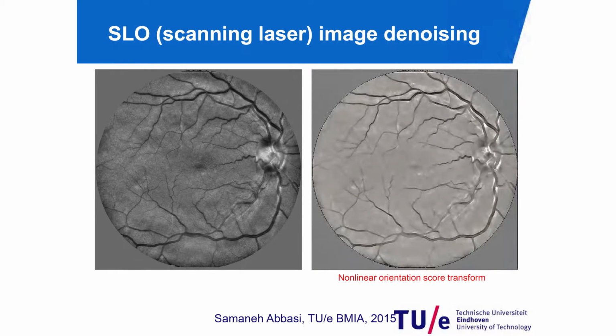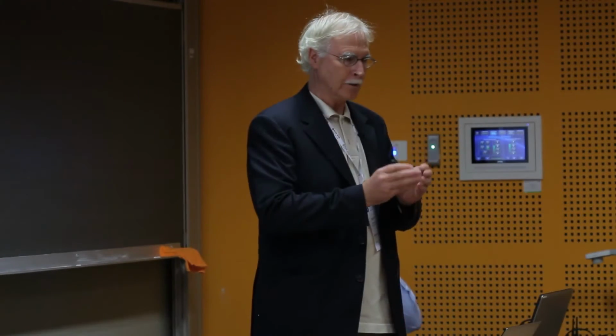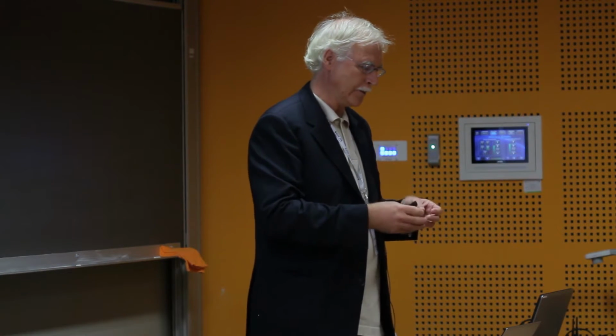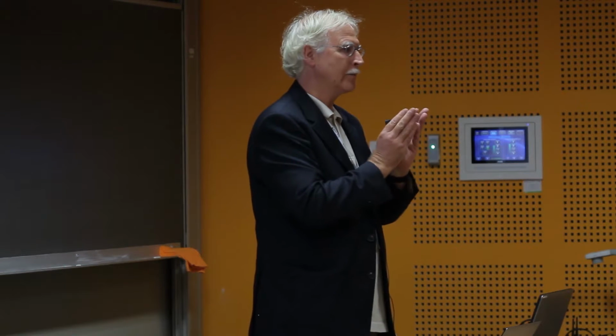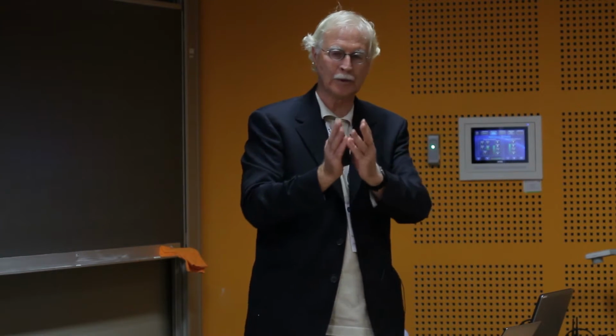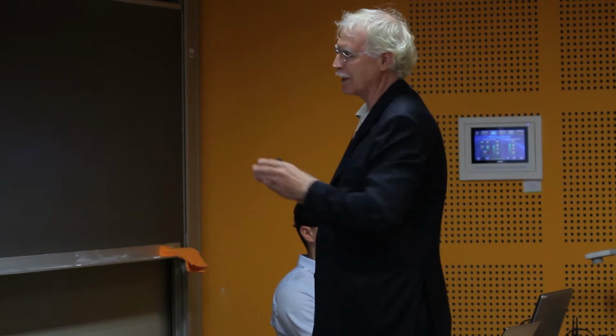And here we have a very nice application of our multi-orientation filters. We made these filters half filters, so they only point in one way. If you stand on a pixel, and suppose you stand on a blood vessel, in this direction you have a lot of output because you measure on the blood vessel. Here you measure next to the blood vessel, there's no output.